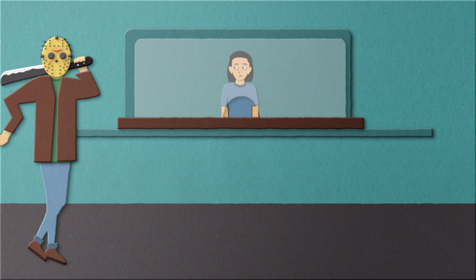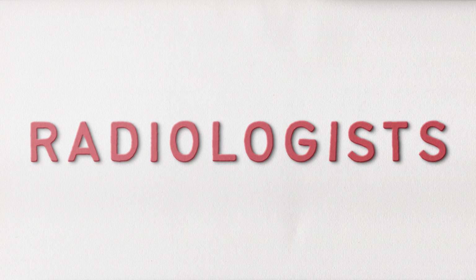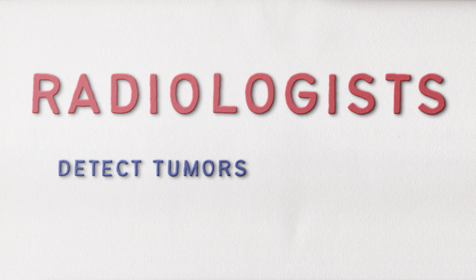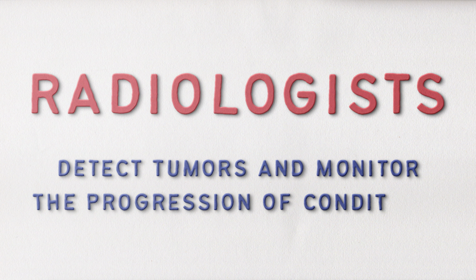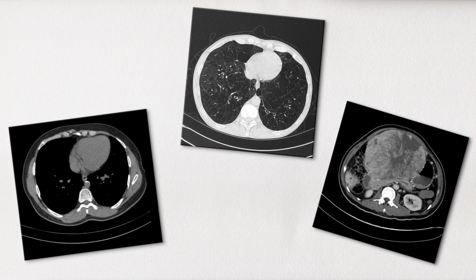CT scans are typically used for complex bone and joint problems, like complicated or unusual fractures. Radiologists can also use them to detect tumors and monitor progression of conditions like heart disease, emphysema, or liver growths.